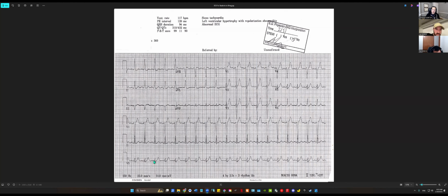All right, so here's something that hopefully you'll notice now, or if not, maybe I'll point out to you. Every feature that you see on the QRS lines up vertically in time. I know for a fact that on this lead, the T wave ends right here.